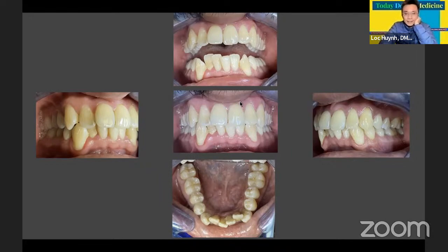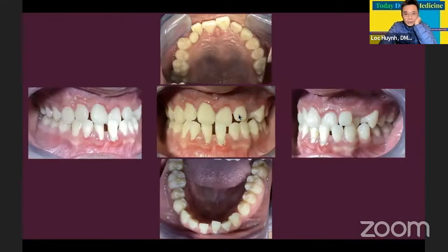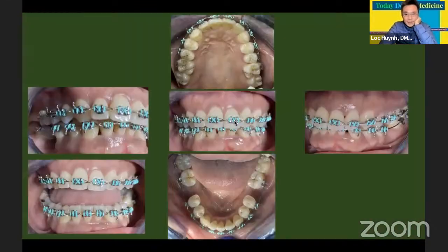This is decent, not so good, because the upper lip here is being closed up. I don't like that. It could be the retractor is really small. So be aware of what you're taking. This is another decent photo that you can see. You capture the gum infection and all the teeth.